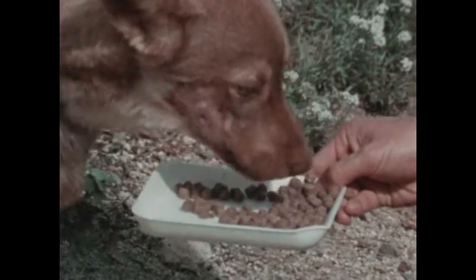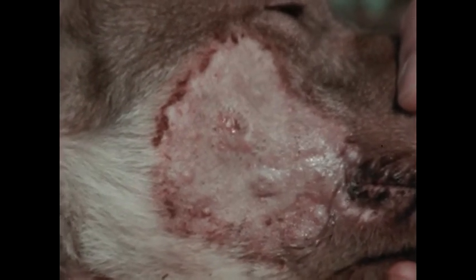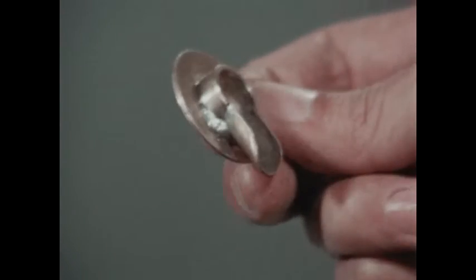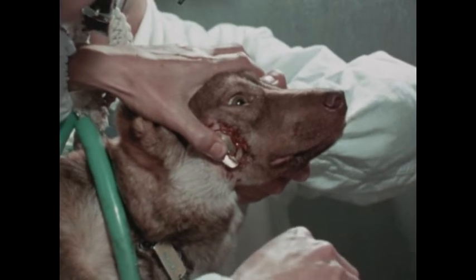The dog can eat normally, and we can see saliva flowing, but it's difficult to measure the amount. We can correct that by attaching this simple device. Saliva will drip slowly down the slide, and we can count the drops. An adhesive will hold it in place.